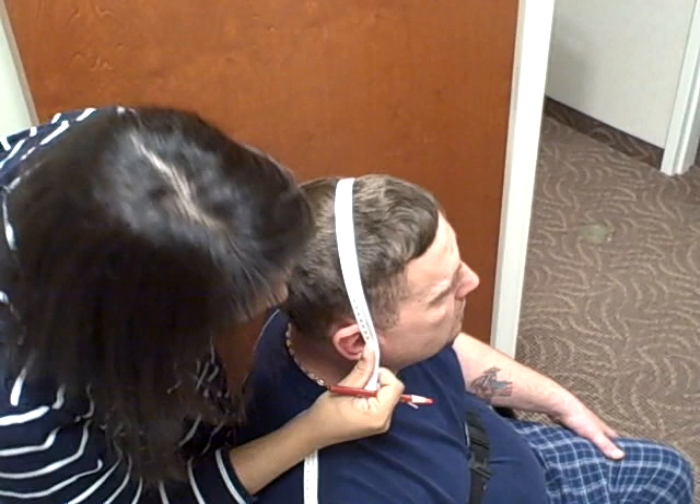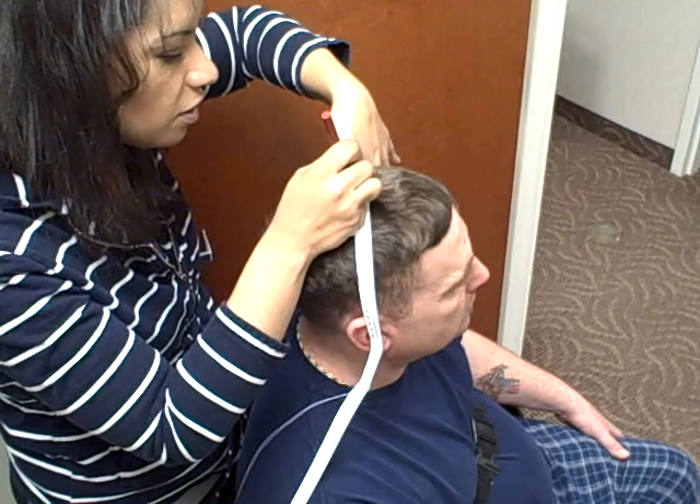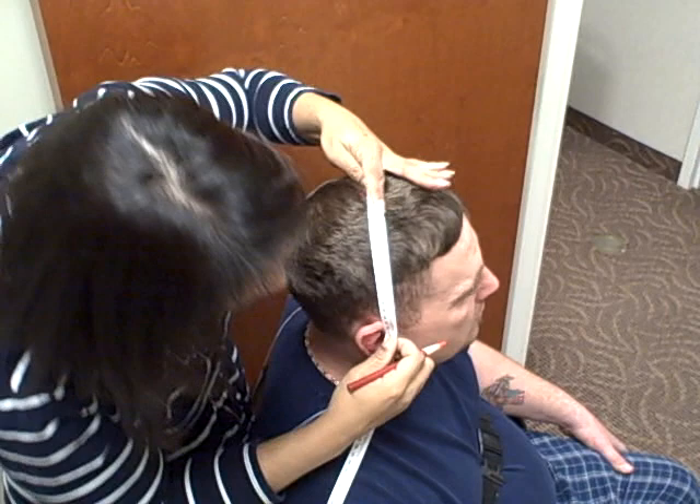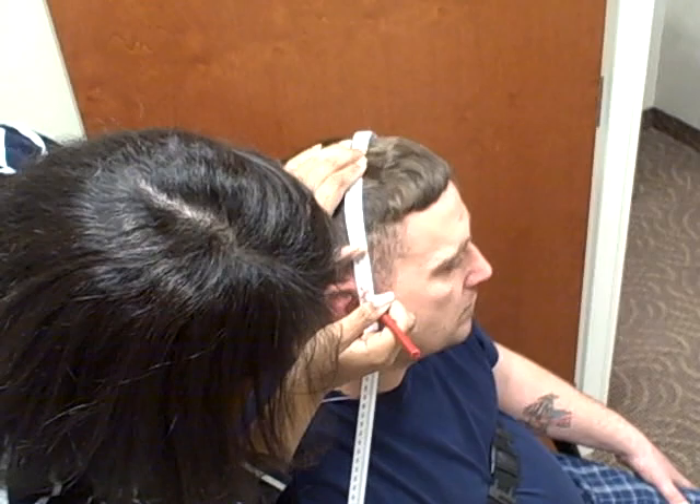You want to make sure that you're going over your original marking at the top of the head, because a lot of times the tape measure will slide forward. That's coming out to 38 centimeters, so I'm going to make a mark halfway.